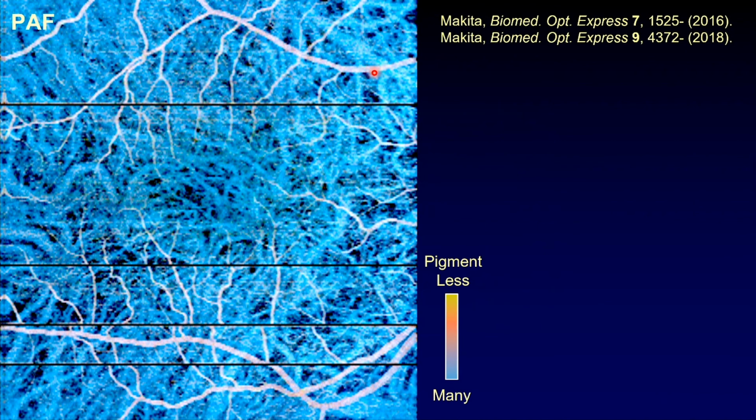It's above the retinal pigment epithelium. For this, we assign the hot colors. And if there is melanin on top, the blood vessel appears in blue, cold colors. That's our definition of the color map. But the existence of the melanin was detected by using the polarization uniformity.